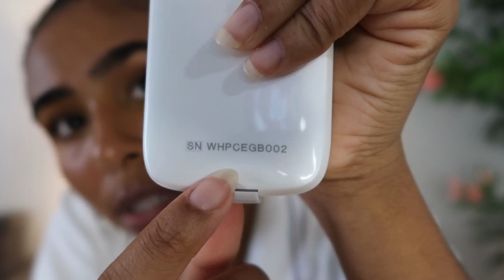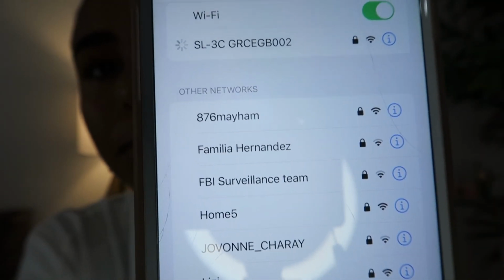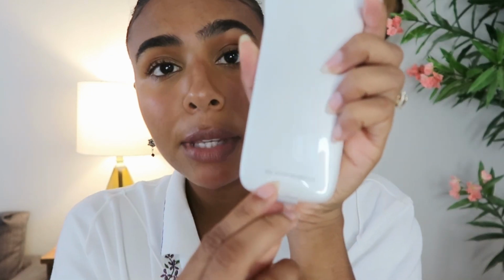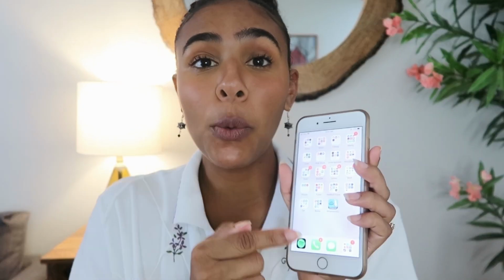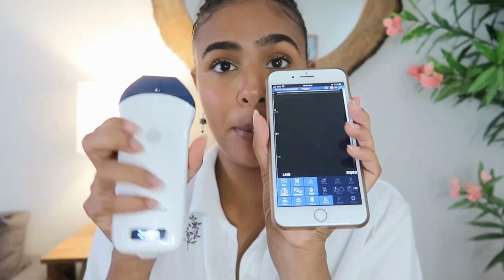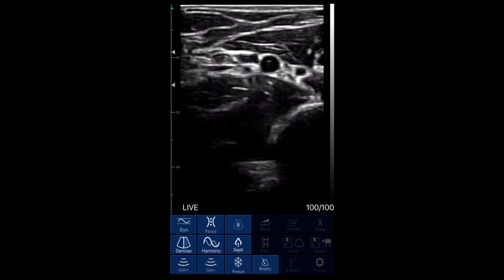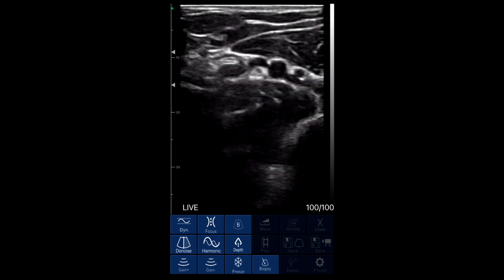So as you can see, what I'm looking for here ends in 002. I'm going to go on my phone because that's what I'm going to be using to scan. Go to my Wi-Fi, and we can see right here, this is what I'm looking to connect to. It ends in 002. So that's going to ask me for my password, and like I said, I'm just going to be using exactly what's on the back here as my password. Now that I've done that, I'm going to go and open up my wireless USG app. This is what it looks like. Here's my probe, and you can see it's connected. I'm hitting freeze and unfreeze. So we are all connected and ready to start scanning. Firstly, I want to start off by scanning my brachial artery.